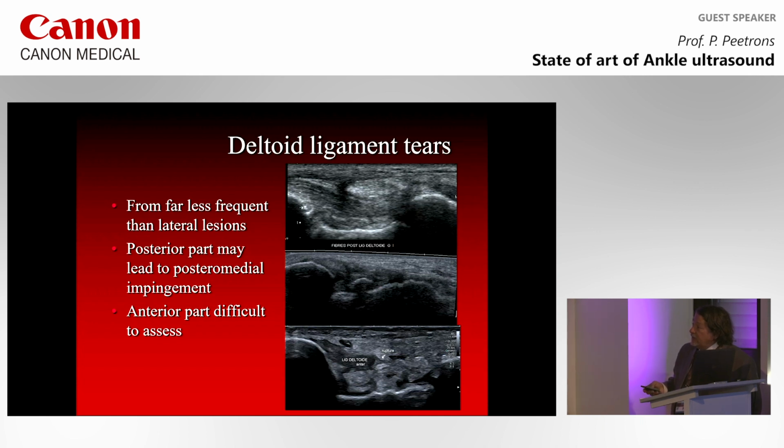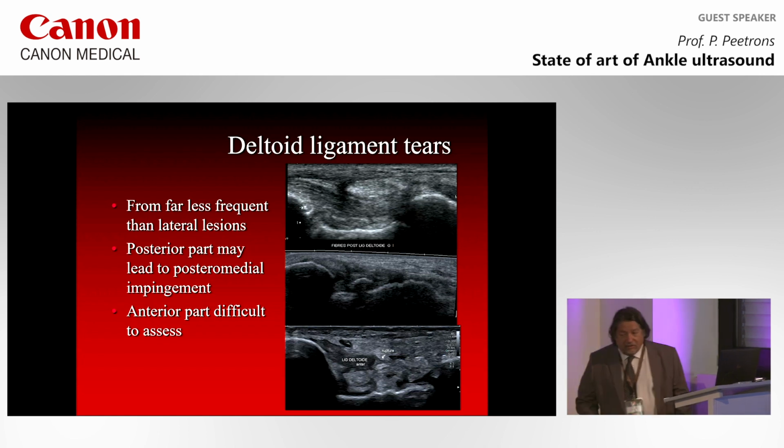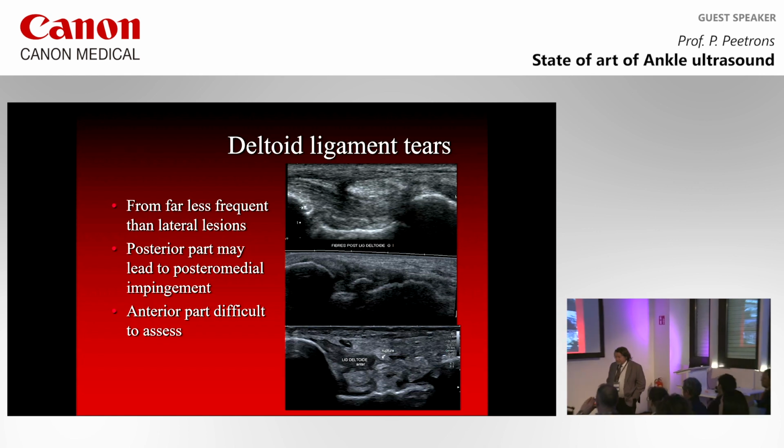And this is the anterior part of the deltoid ligament from the tibia to the anterior part of the talus and the navicular. And you can see that there is a bump here. There is a stump here of the anterior deltoid ligament with no ligament coming from this to the talus. So this is a little bit tricky. I will show you how to do.